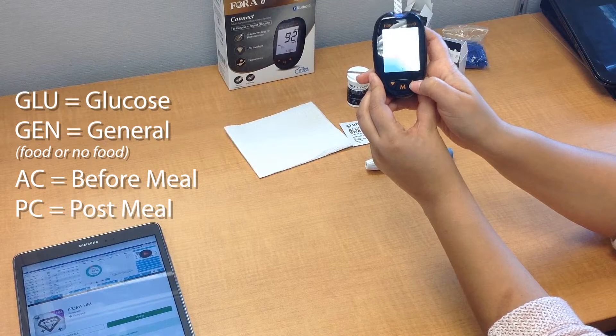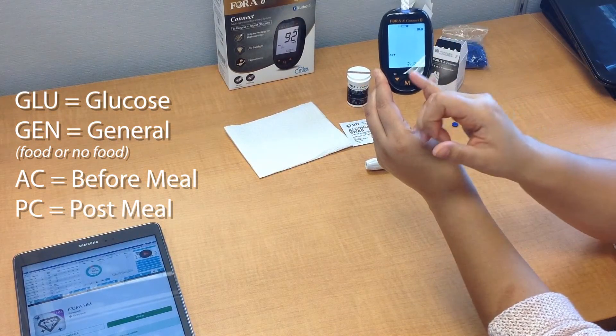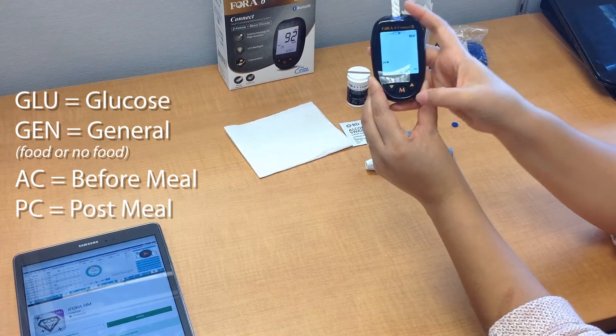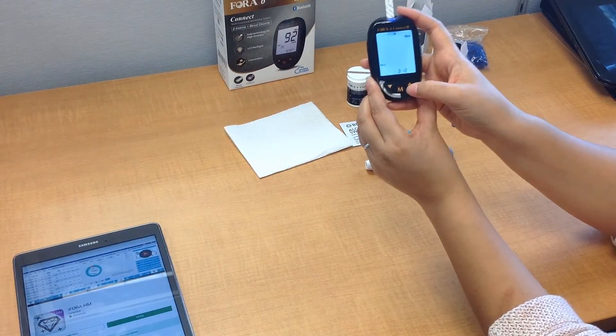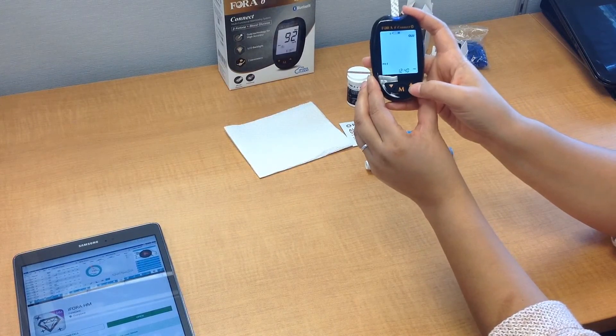Now, if you were fasting or you haven't eaten yet, go ahead and press the button up and you'll see the letters AC come on — that means it's prior to eating. And then if you press it again, the letters PC will come on. This is post meal, after you've eaten. So depending on the time of day that you're testing your blood glucose, that's what you would select.